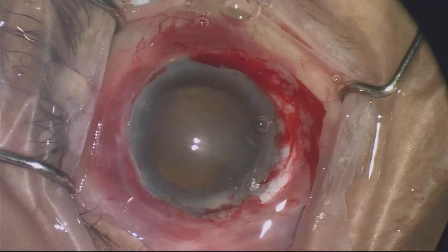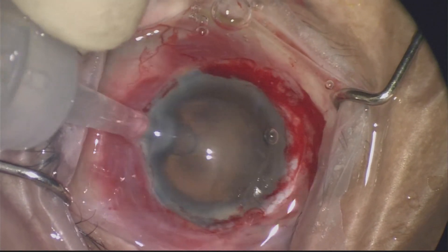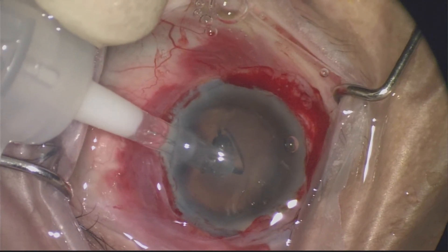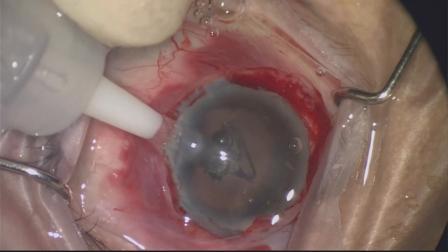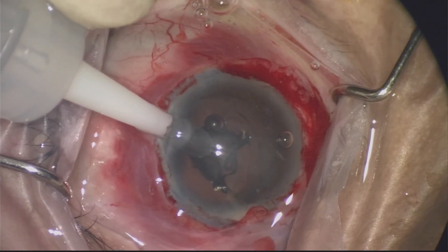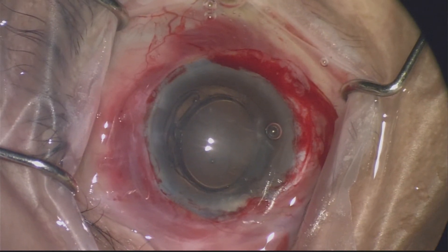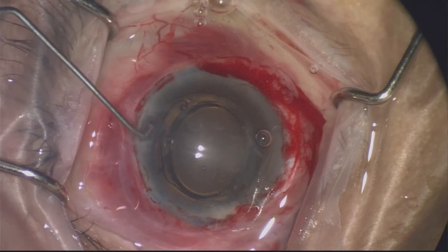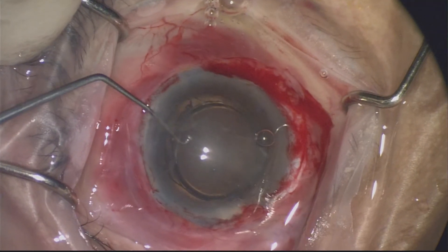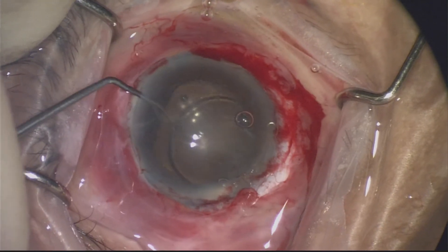Here I'm splitting the lens and now inserting the new intraocular lens. I use a hydrophobic lens in these cases, especially with the risk of needing a corneal graft in the future, and I'm very gently inserting it. A portion of the video was corrupted so I can't show the lens removal and bimanual IA, but there was very little cortex to remove. You sometimes get tiny fibres on the periphery of the capsule and capsular remnants that you want to remove very gently.